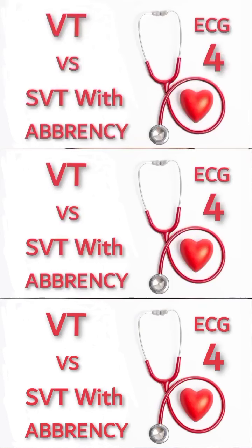Bismillahirrahmanirrahim. In this video I am going to cover a very important topic, and that is wide complex tachycardia and the algorithm we must follow when a patient presents with wide complex tachycardia, whether it's ventricular tachycardia or the other differentials like supraventricular tachycardia with phasic aberrancy, or supraventricular tachycardia with pre-existing bundle branch block, or the pre-excitation pattern with different kinds of tachyarrhythmias. But one thing we must always remember is that whenever a patient presents with wide complex tachycardia, it should be considered as a ventricular tachycardia and treated accordingly unless and until proven otherwise.